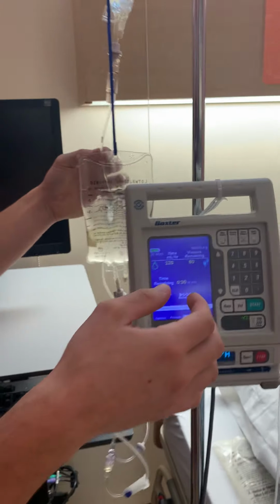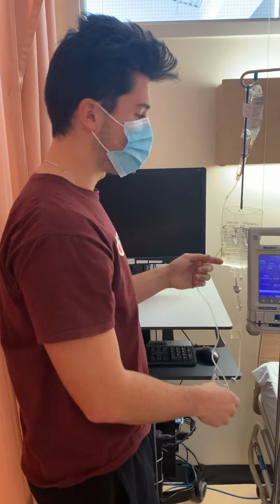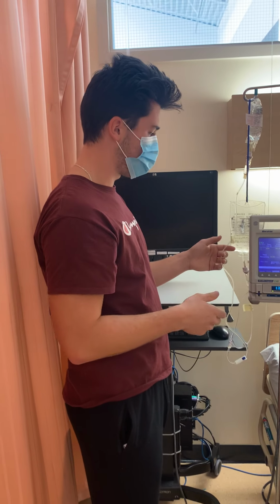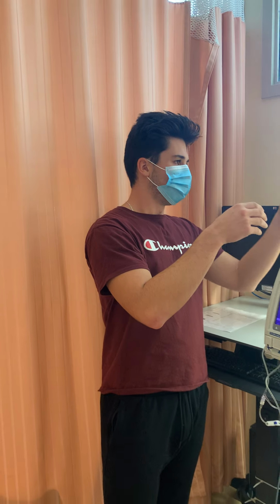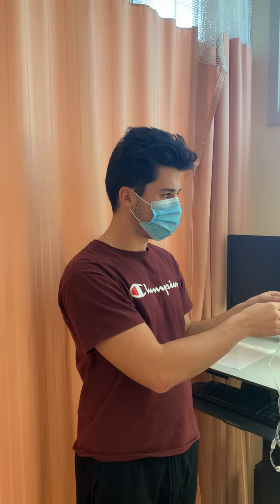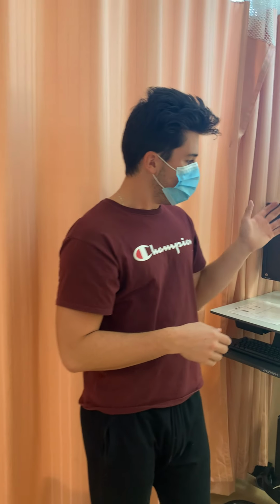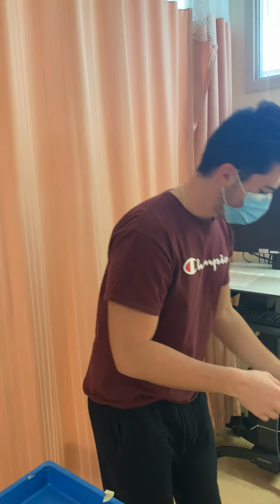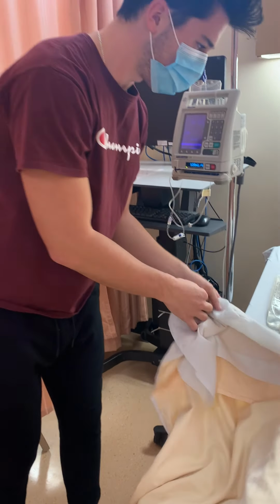Now that my secondary is infusing, I'm going to watch for 3 drops, ensuring that the medication is infusing, so I can see that the 3 drops have come out, so I know that my medication is infusing. Again, there's no air bubbles, and then I can go ahead and label my tubing. I'm going to label with my name and date, so I know when the tubing has to be changed, and I've seen also that on the primary they have their tape for when it has to be changed. Now that I've ensured everything is running, I can quickly assess my IV site, and again ensure that there are no complications and they're having no pain.